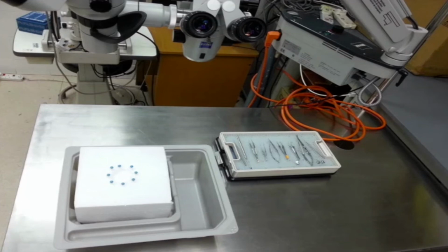The most important point in the wet lab, definitely, is that at the end, none of the animal eyes or even the artificial lens and eye models is similar to the human eye. But the coordination that you are able to learn and achieve by going to the wet lab with all these procedures, you will see makes you different compared to those who have never attended the wet lab before.